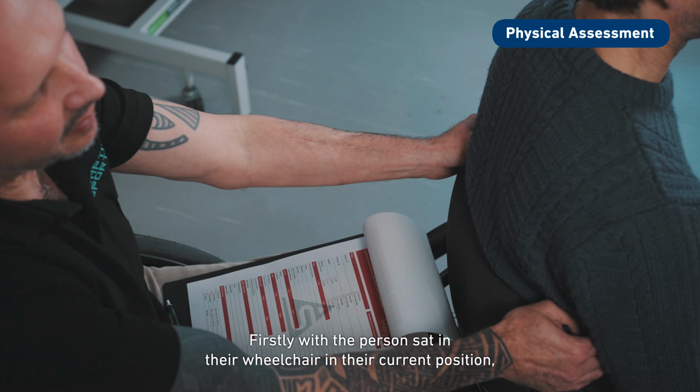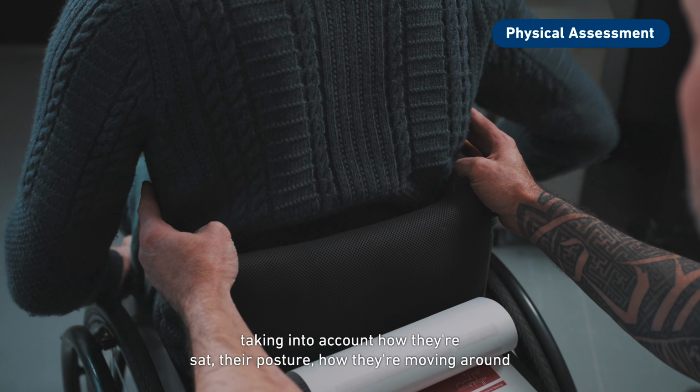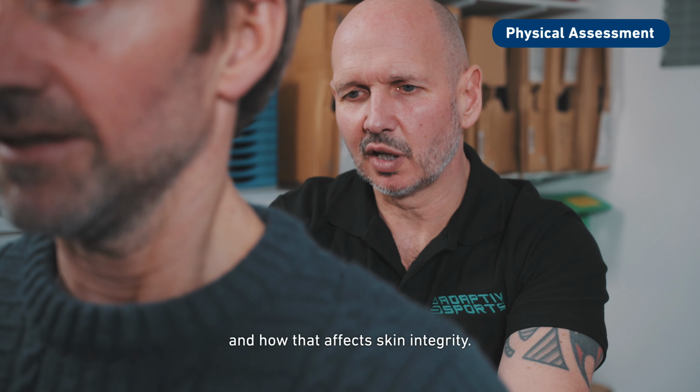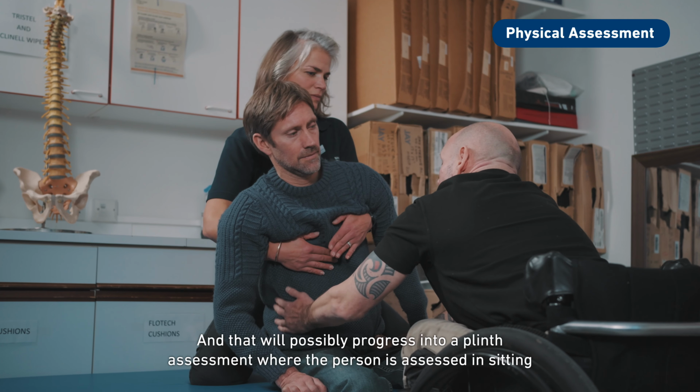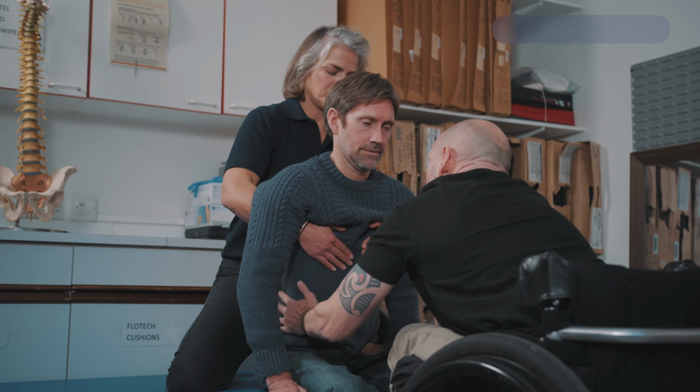Firstly, with the person sat in their wheelchair in their current position, taking into account how they're sat, their posture, how they're moving around, and how that affects skin integrity. And that will possibly progress into a plinth assessment, where the person is assessed in sitting and possibly lying on the plinth.